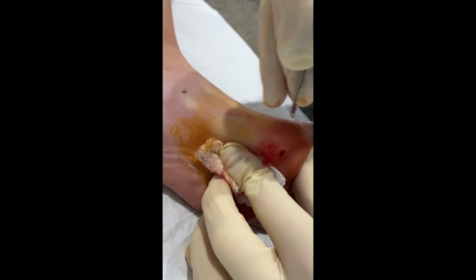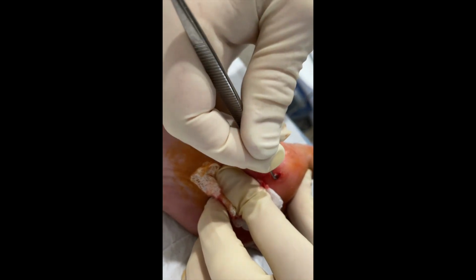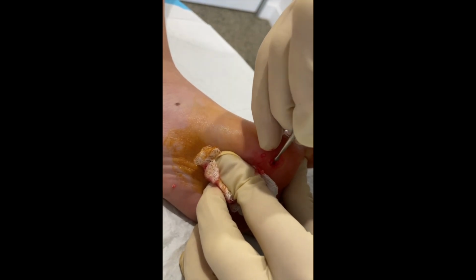So you'll see here that I continue to scoop and clean up around the edges as best as possible to try and make sure that all of the infected tissue is out as best as we possibly can.